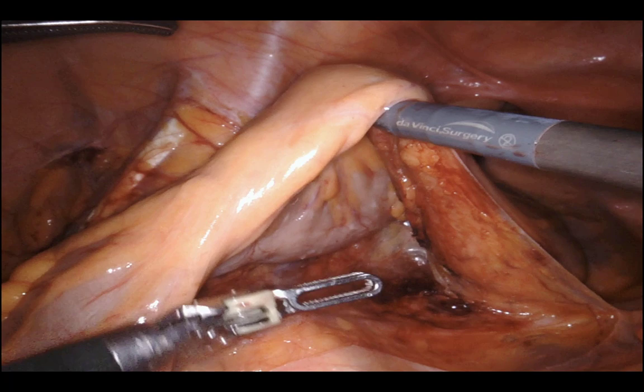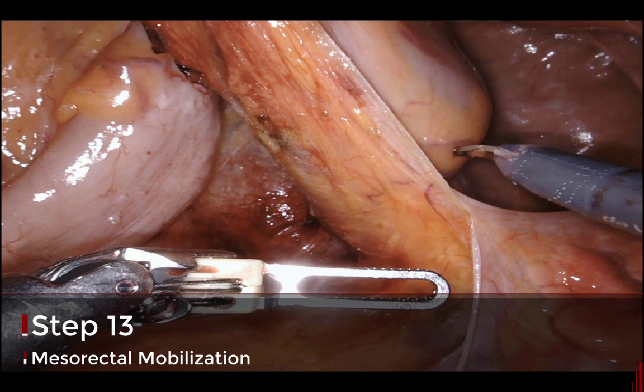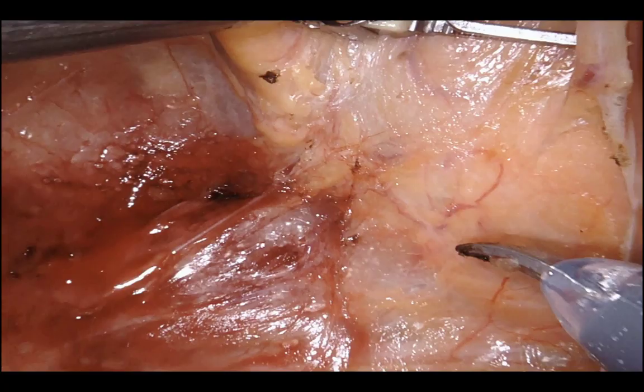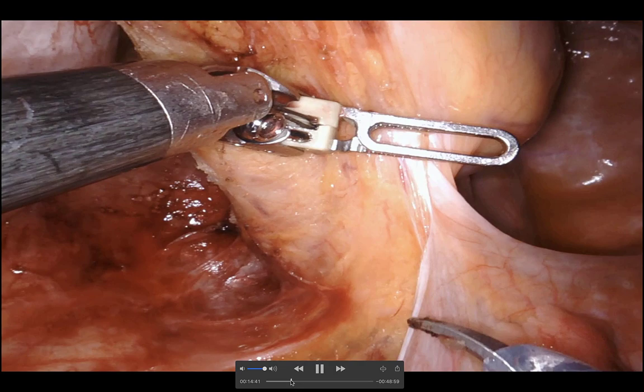The third arm comes in with the tip pointing away, grabs the meso-rectum at the recto-sigmoid junction, pinches and pulls to the head — giving excellent pelvic exposure. I'll do a bit of a TME in this case because the patient had a recto-sigmoid tumor. Even though I consider this a sigmoid resection, it represents a lot of what a TME or tumor-specific mesorectal excision looks like. Getting into the pre-sacral space.